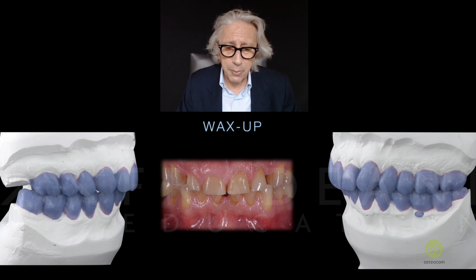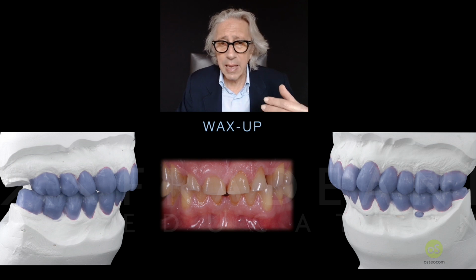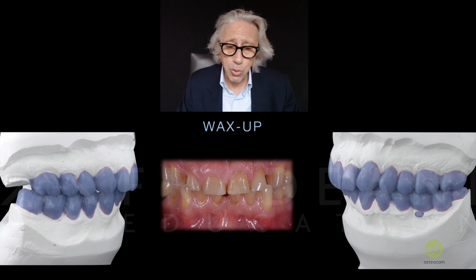So, the wax-up represents practically what? Representing, of course, the treatment plan that you, the clinician, have already seen, looking at all the aesthetic and functional parameters, as already said. So I want to see this kind of situation in the mock-up, to really mimic what I can do with my case, grinding the teeth, taking the impression, finalizing the case.